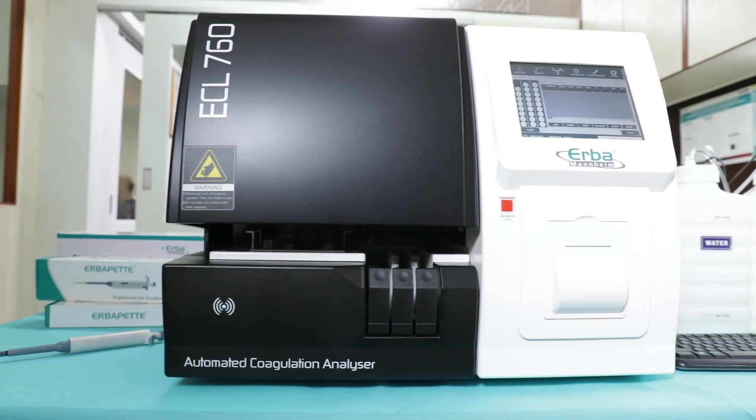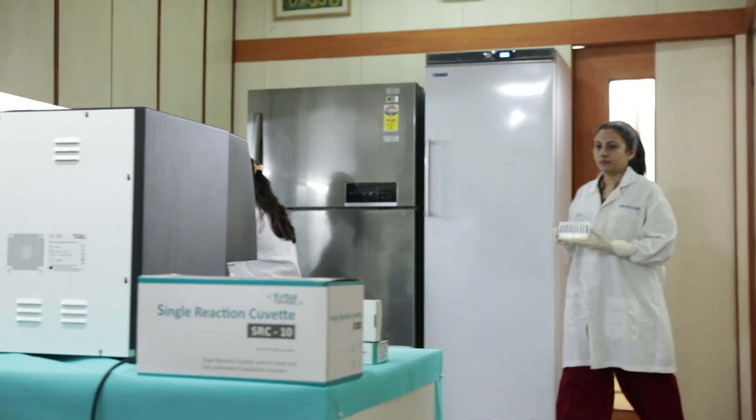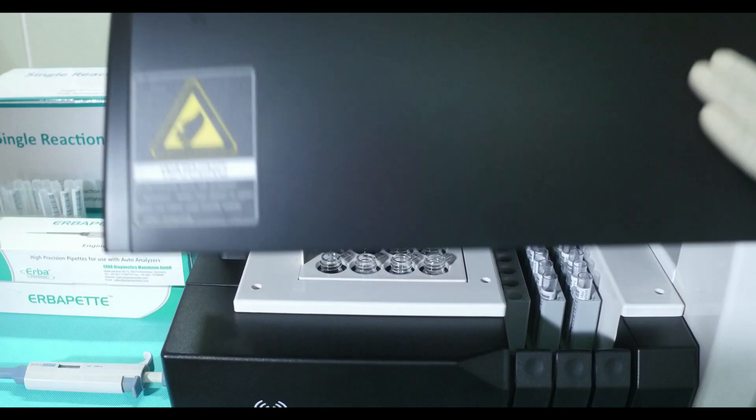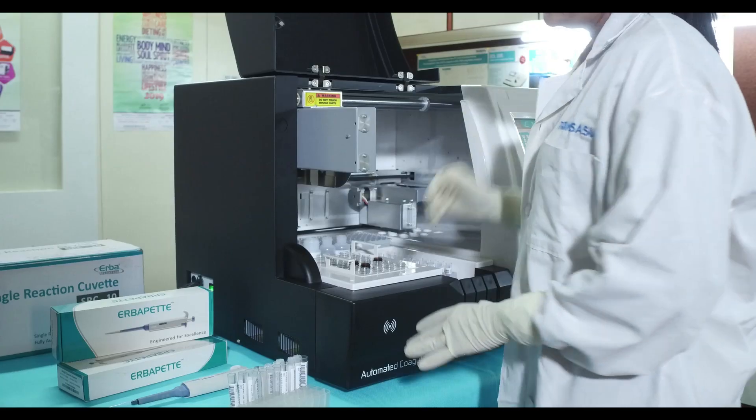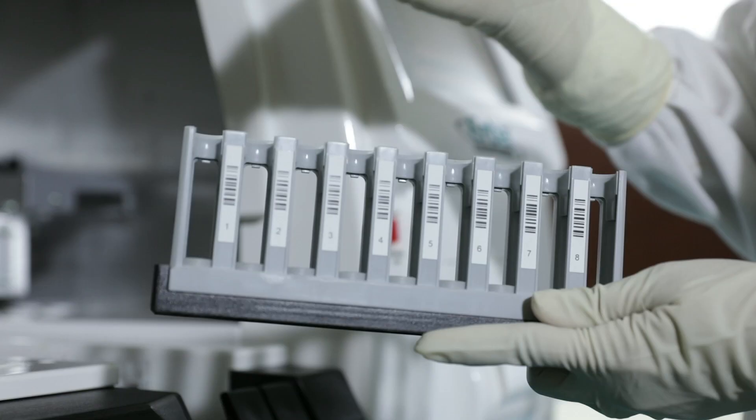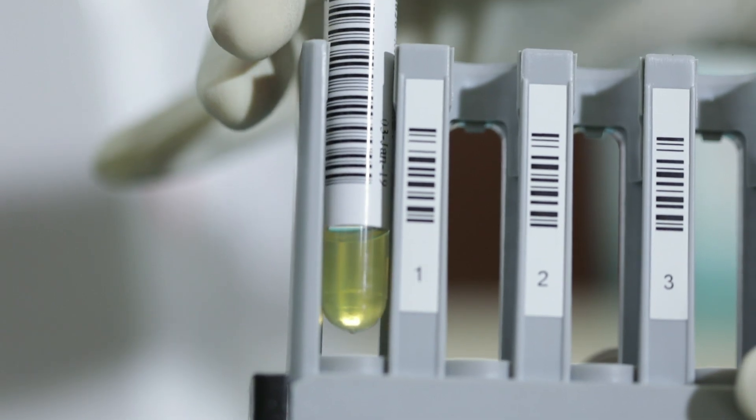ECL760 is a seven measuring channels analyzer and can perform 60 PT per hour. A compact instrument with small footprint, integrated PC with touchscreen and thermal printer makes it an ideal, fully automated choice for mid-range workloads.